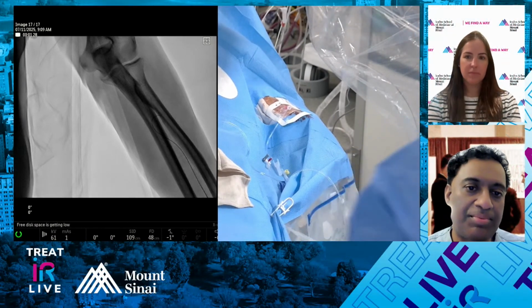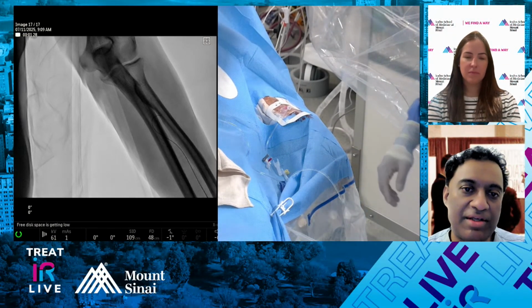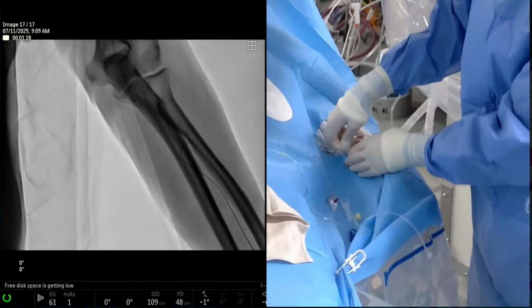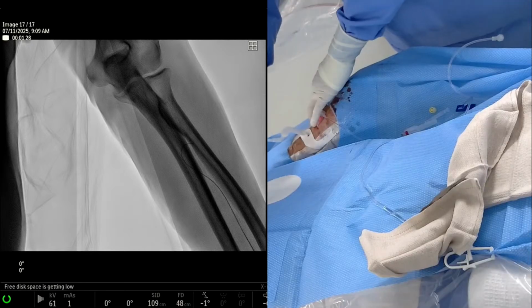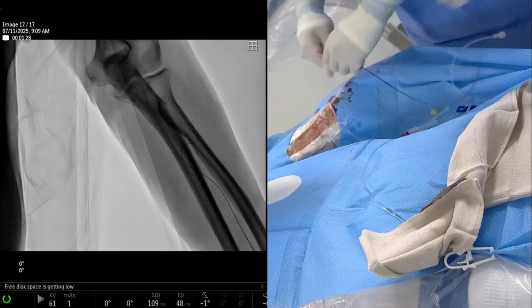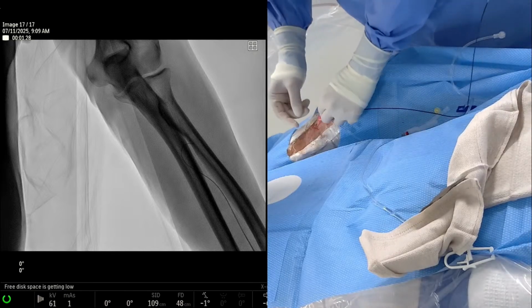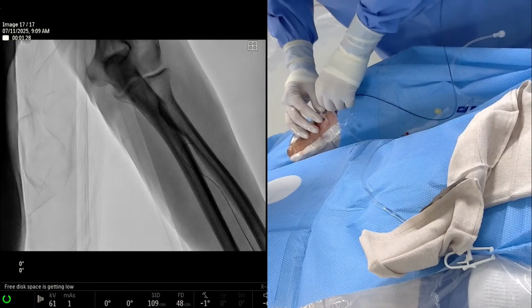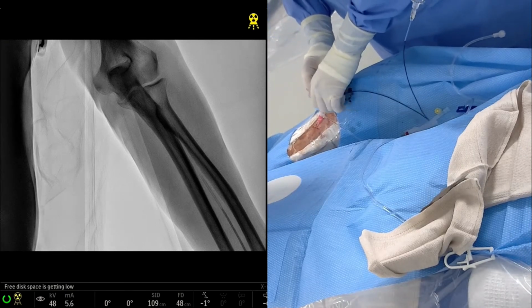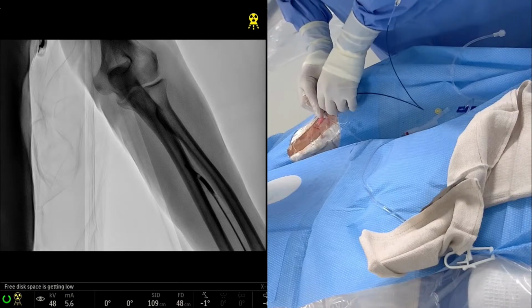Do you ultrasound it perioperatively to look for this? So, when we first started doing radial, we actually did an experiment where we pre-op ultrasounded 50 patients to look for a radial loop, and we didn't see any, so we stopped doing it. And how do you explain to everyone what a radial loop is, how you can get in trouble with it, and how do you navigate around it?